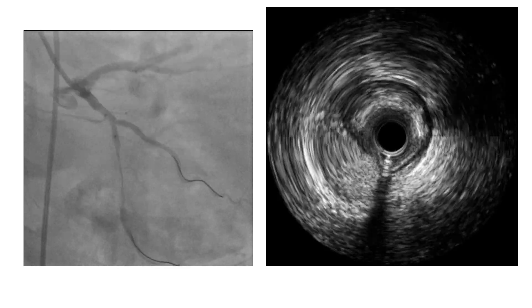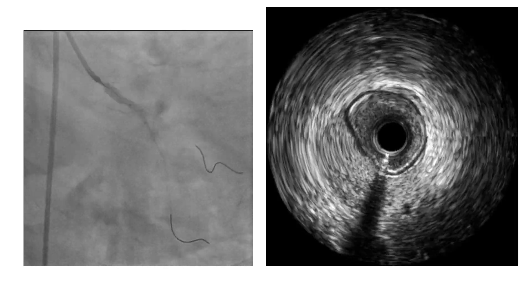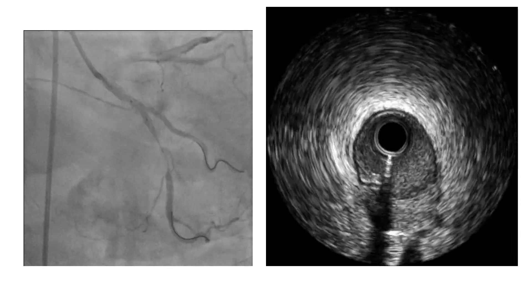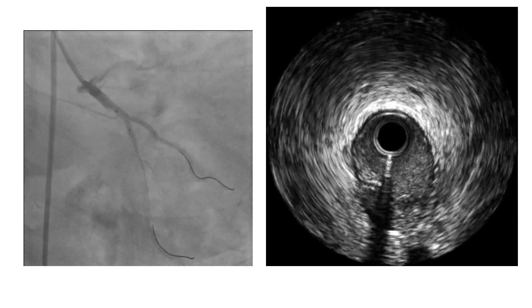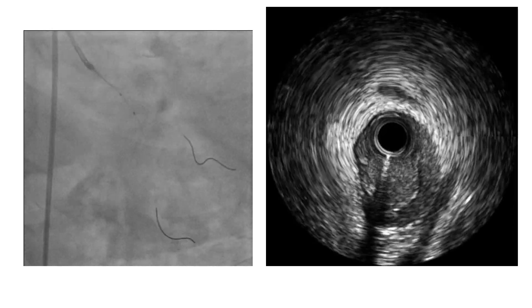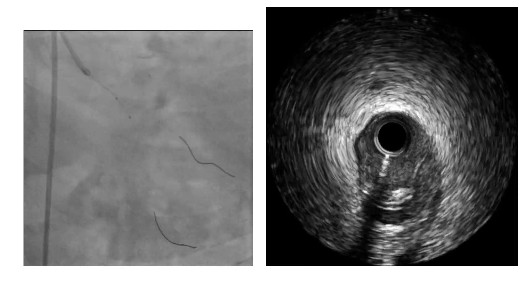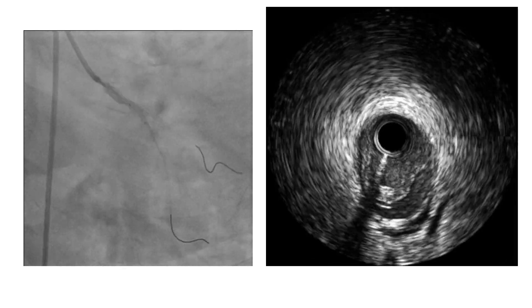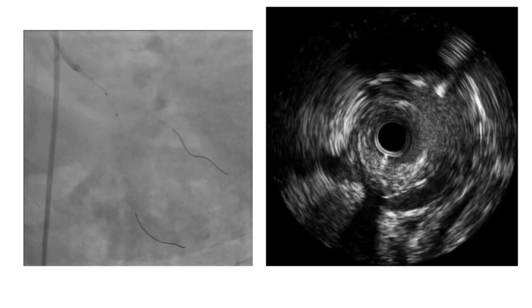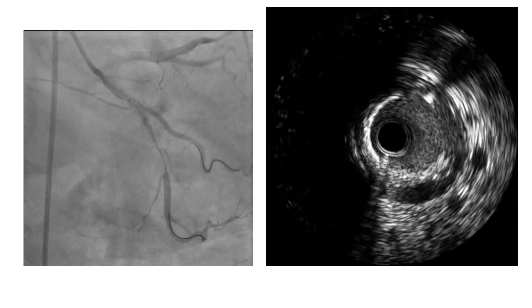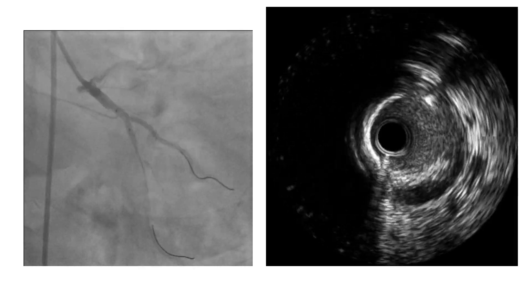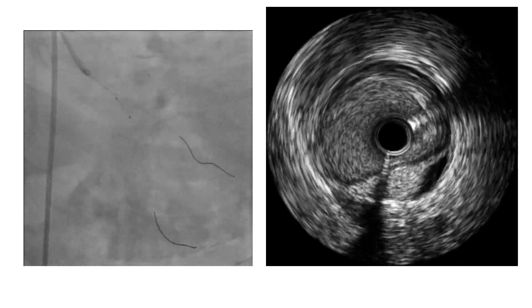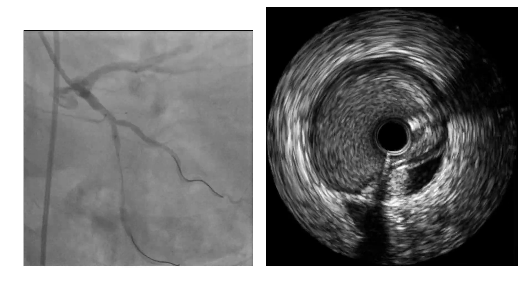Now we are at the level of the proximal circumflex, coming to the level of the proximal bifurcation. This is still within the hematoma itself. We can see a single wire, and now another wire comes into view — this is the bifurcation. Proximal to that, we can see the hematoma extends proximal to the bifurcation.